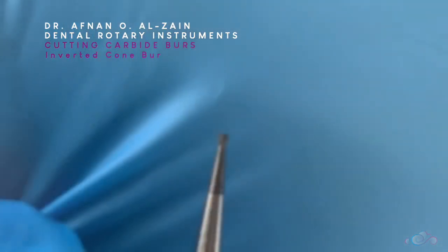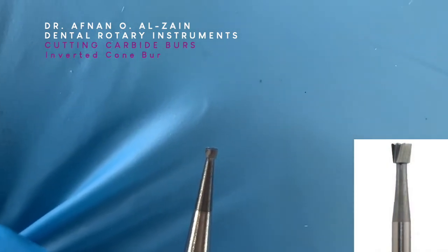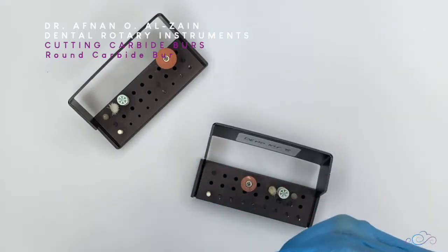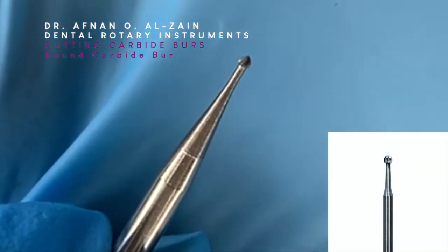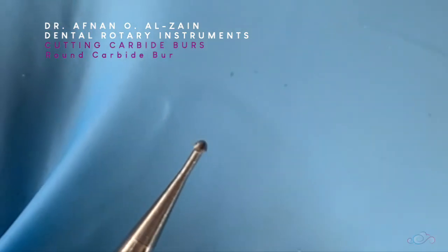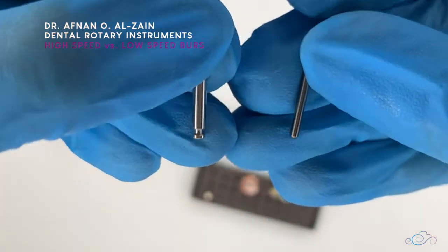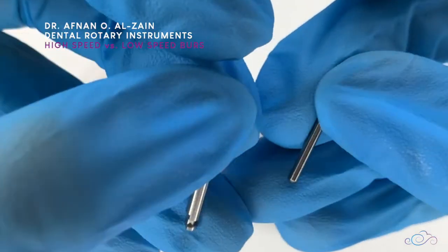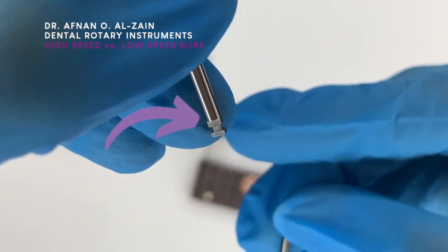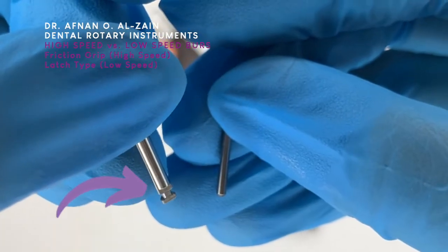Then we have the inverted cone burr. We can see from its shape that it is like a cone but inverted, and it has a flat end. After that, we have the round carbide burr — it is rounded in shape. All of these burrs come in different sizes, and they come either in high speed or low speed. To know the difference, look at the bottom: if it is rounded and smooth at the bottom, this is the high speed — called the friction grip. When you see a little notch, this is the latch type, which means it is low speed.